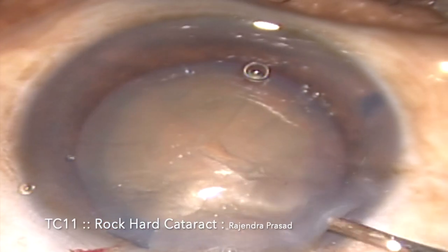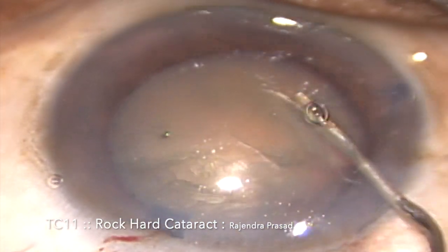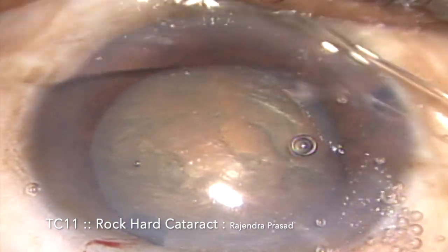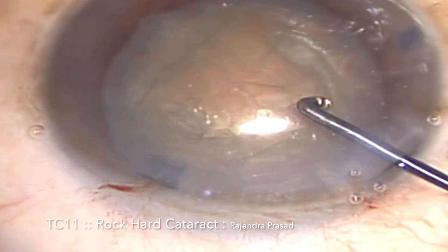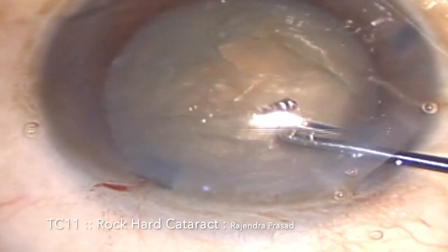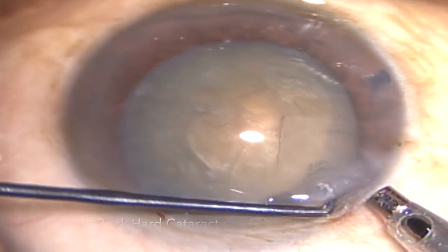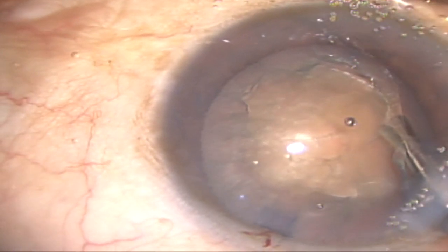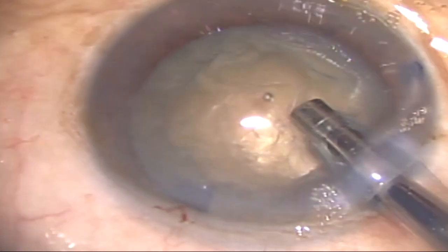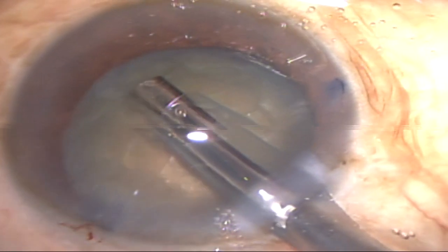Once the rhexis is complete, the hydro procedure is in progress with hydrodissection and hydrodelineation to separate the nucleus from the cortical material, and then rotating the nucleus to certify that it is free within the capsular bag. Then with the help of the FACO probe, the anterior cortex and the epinucleus is aspirated to visualize the anterior surface of the nucleus. We can see that the nucleus is looking quite brown and seems to be a very hard nucleus.